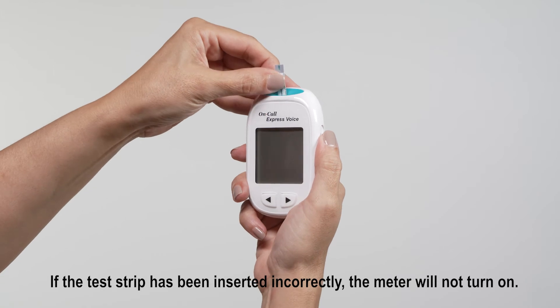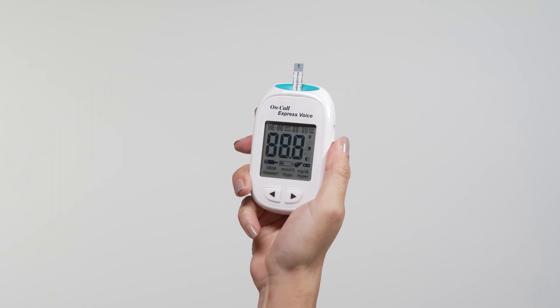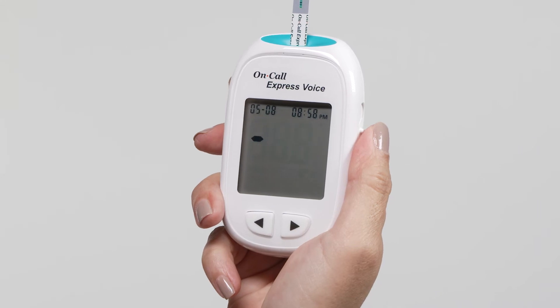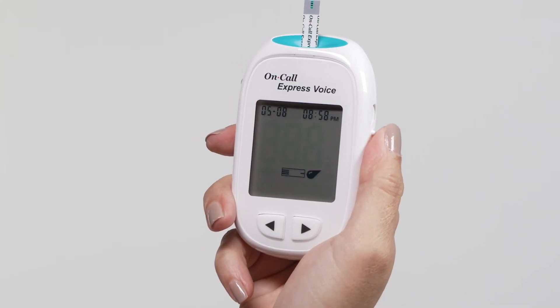If the volume is greater than zero, the meter will voice power on, signaling the meter is turned on. The display will turn on briefly with all the icons and segments turned on. The display will then show only the date and time, with a dash moving across the display and say: Please wait.